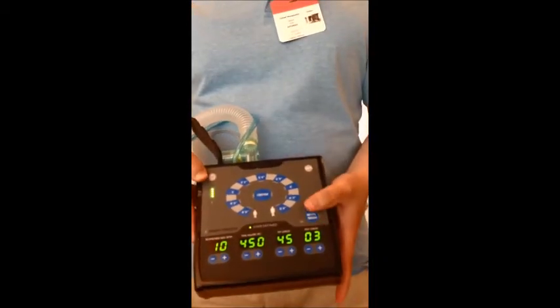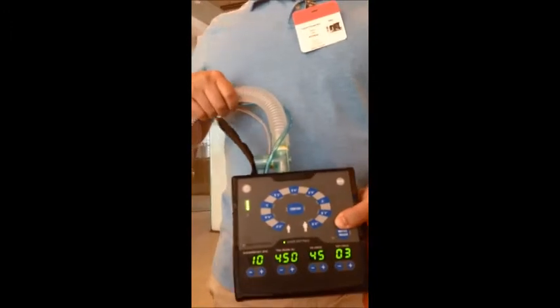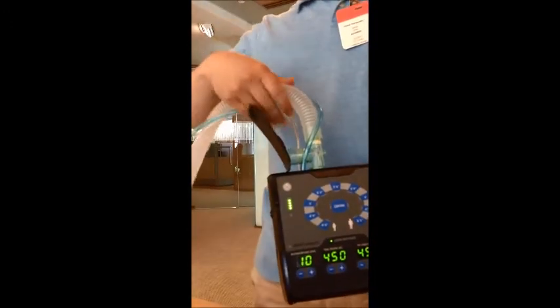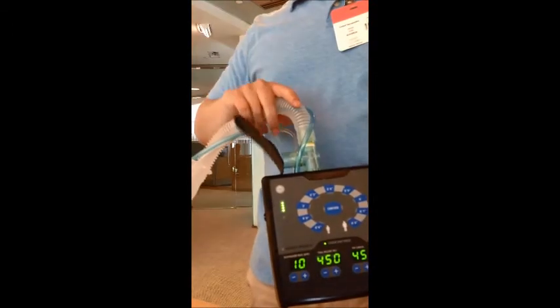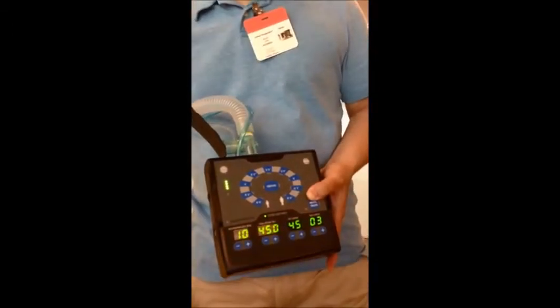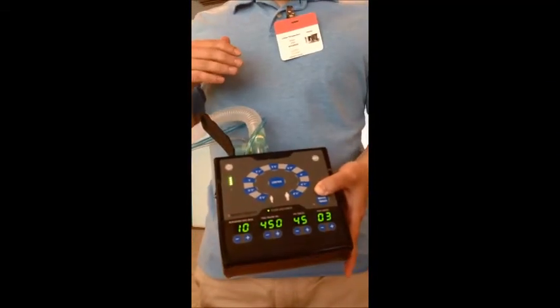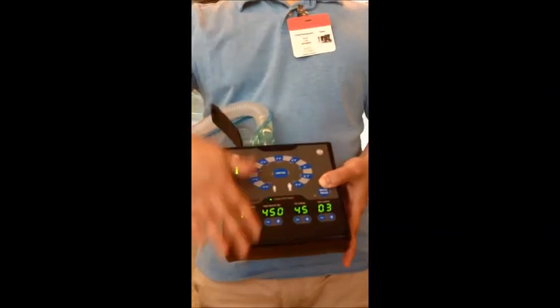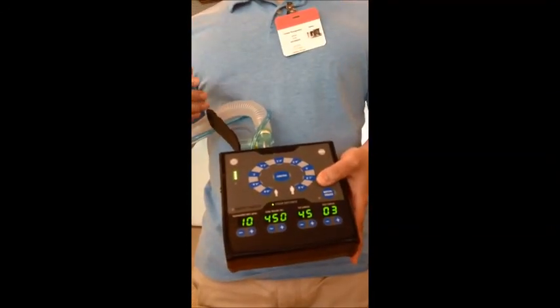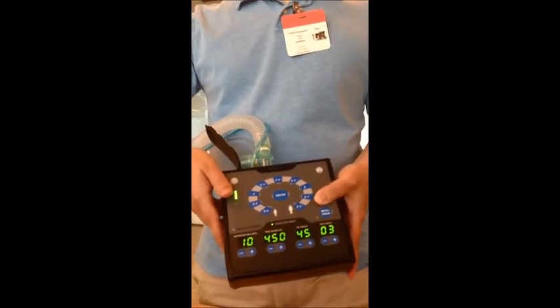And so right now, in terms of decontamination, this is a single-use patient breathing circuit. So once it's done with that particular patient, this will be cleared, and you can get rid of it and replace it with another circuit. All the exhalation is coming out of the valve on the outside, so it's not going back into the ventilator. In terms of just normal contamination, it can just be wiped down with a soft cloth. So there's nothing that's getting back into the unit, so this can be reused for another patient.